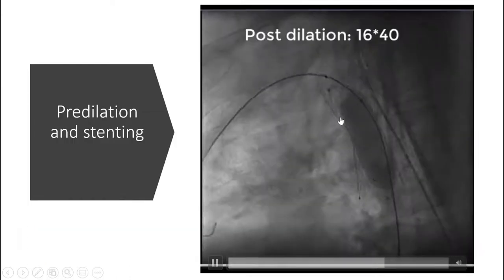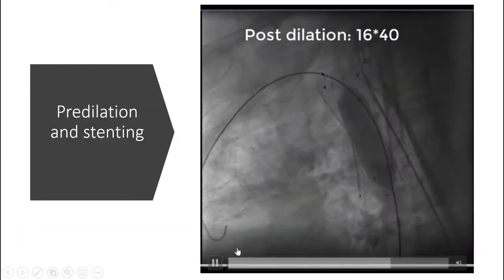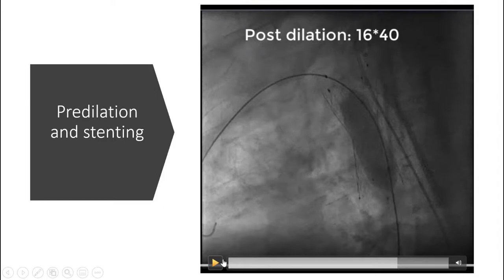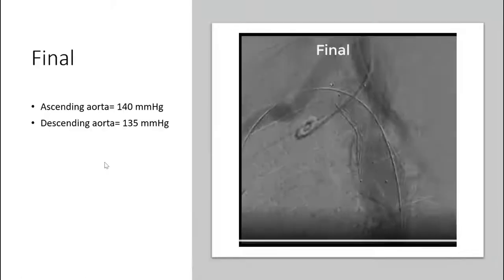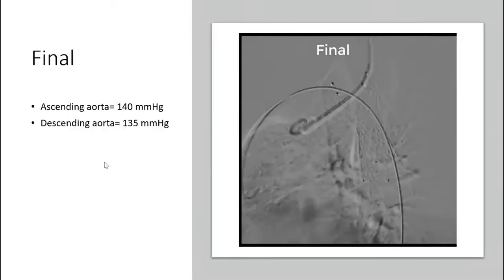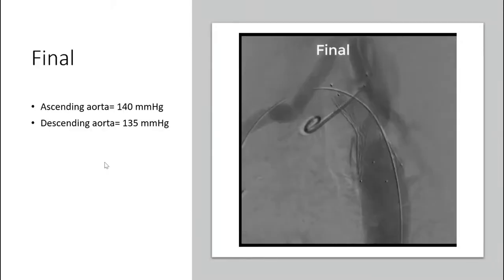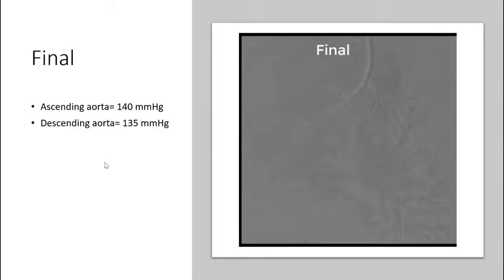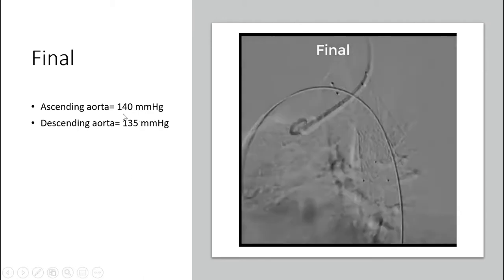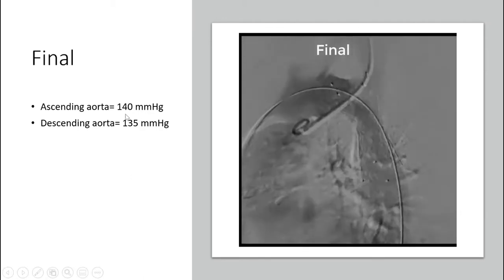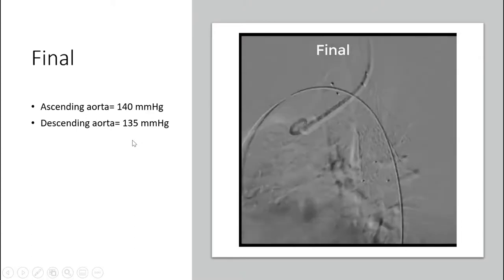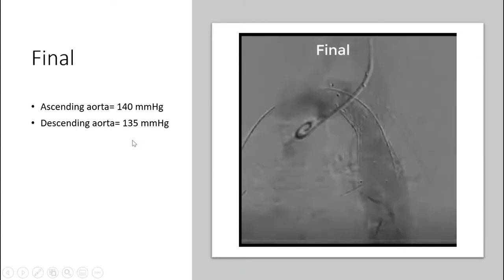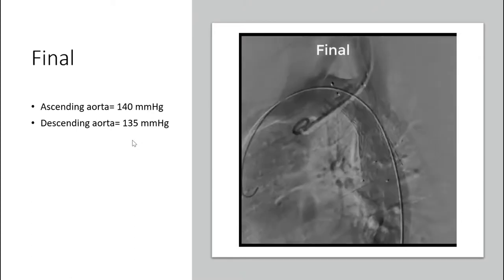As it is a bare metal stent, there is no stoppage of flow to the right subclavian artery. Afterward, we performed post-dilation with a 16 mm balloon. You can see the final result. After placing the stent, the ascending aorta systolic blood pressure decreased to 140 mmHg, while the descending aorta systolic blood pressure was about 135 mmHg.